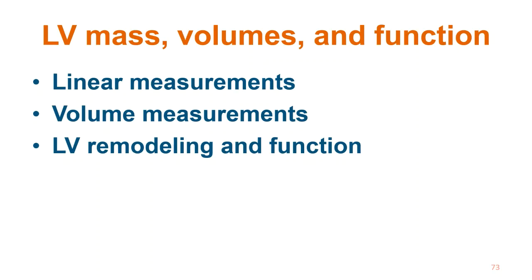the relative wall thickness, meaning the ratio of the wall thickness to the left ventricular cavity dimension, seemed abnormally high. But I think it is important for us to use the term the same way. And I would urge you to confine the term left ventricular hypertrophy to those patients who have an abnormal increase in left ventricular mass index, or indexed to body surface area.